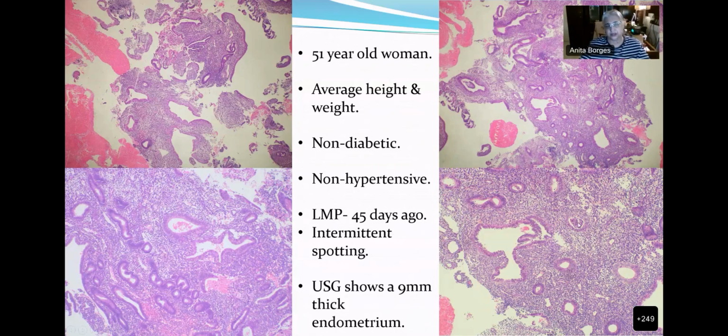Now, do you see anything else that you might want to notice over here? Do you see something here in the right-hand corner in this funny-looking gland? Let me see if I can annotate it. Do you see anything here? What do you see over there? Even at this far, you can see it. This gland is cystically dilated and showing branching and some sort of metaplasia, no?